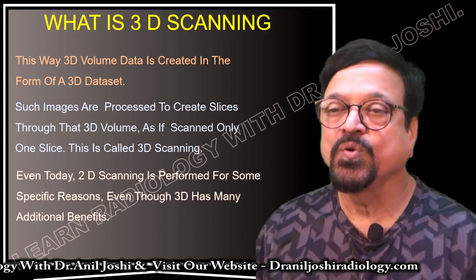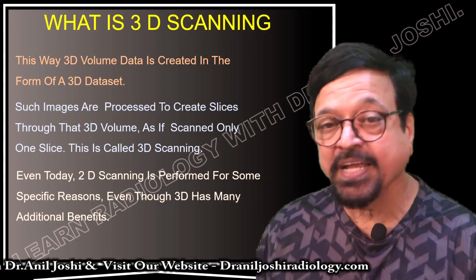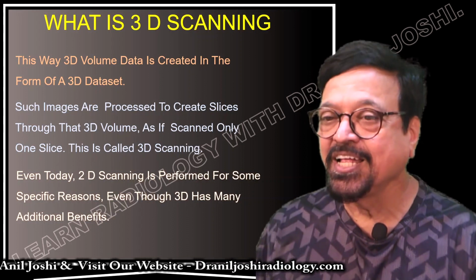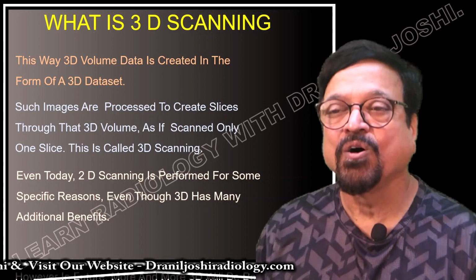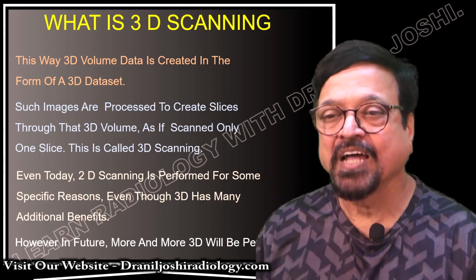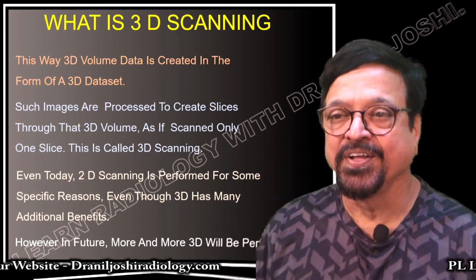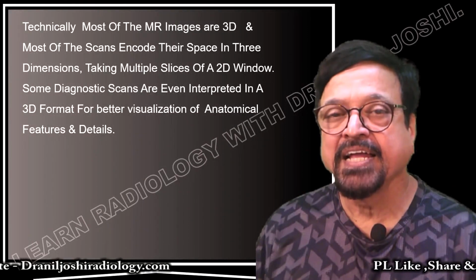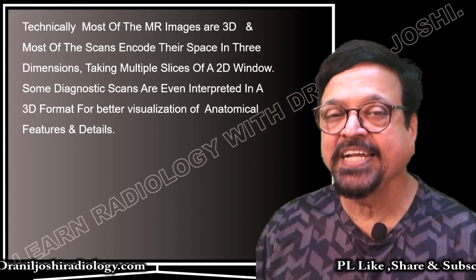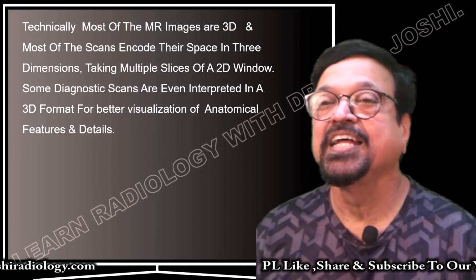Even today, 2D scanning is preferred for some specific reasons. It's a different topic, will be covered in different lectures. Even though 3D has many additional benefits, the best way is to have both. However, in future, more and more 3D will be preferred. So even though today certain machines go from 2D by stacking the slices to 3D, a direct 3D volume acquisition will be possible in the future.